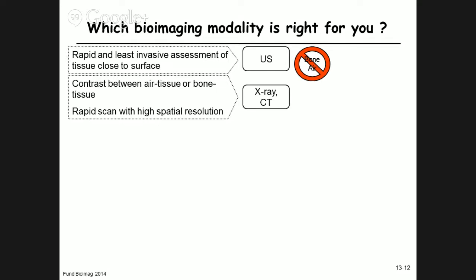You've got pneumonia, you go to the doctor, what does the doctor do? A chest X-ray. How many of you have had pneumonia? Me too. All right, so you probably underwent some X-ray where they looked for the fluid accumulation in the lung. You want it to be rapid because you're not going to stick in an MR coughing like crazy because you're going to move. So the chest X-ray is the fastest.